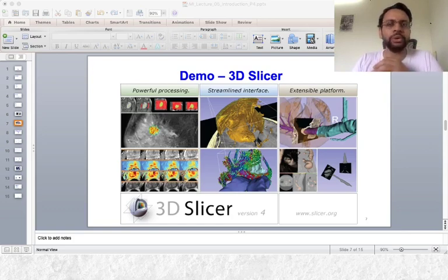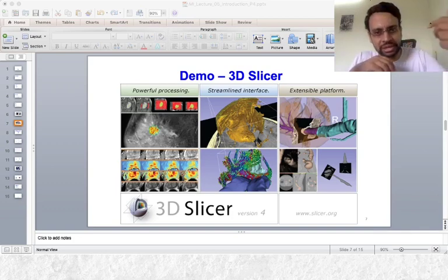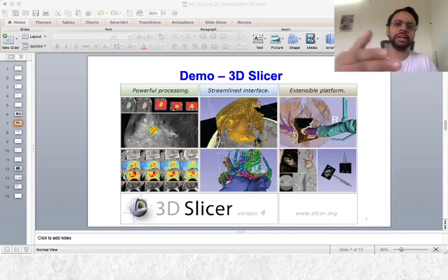Let's say you want to build a template that you could use to compare with the functional MR imaging of another subject and see where you could see a significant difference in the functional response. So this allows you, for example, to make a normalization from multiple images, create a normalized image, compare with a new image, and then say that the response in so and so regions is statistically significantly different from the normal image, and so on. This is like a toolbox built on top of MATLAB.